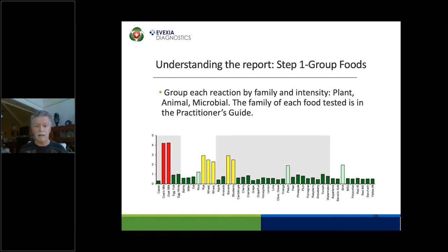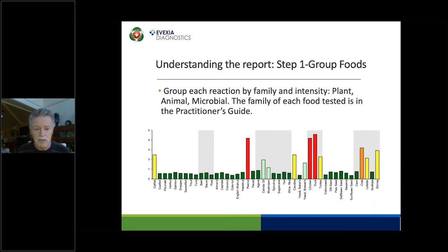So again, a nuance. And then you look at the aqua ones like peach and BHA. Now they're 1+. While we say don't focus on them initially, you keep them in the back of your mind and say they're positive. We're going to deal with the high reactives first, and then if we have to, we can come back to those and see if they play any role. The next slide shows another panel from the FIT 132 or 176.